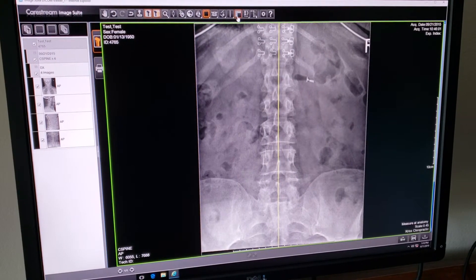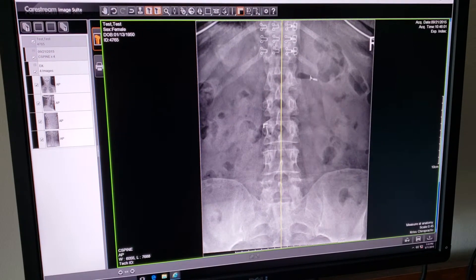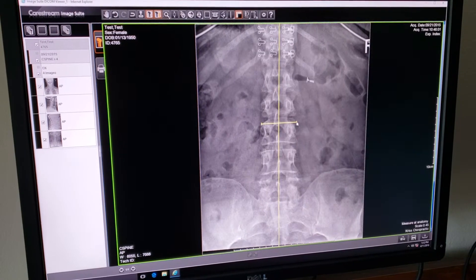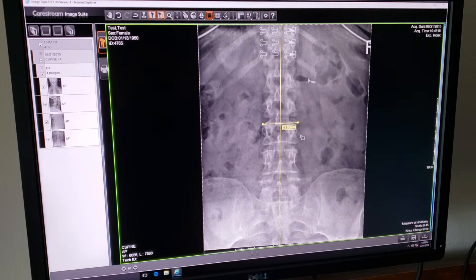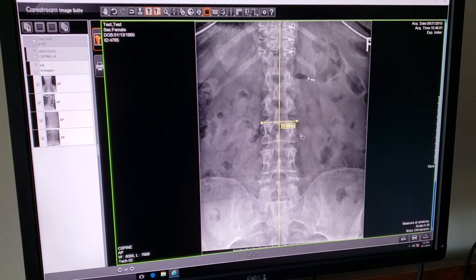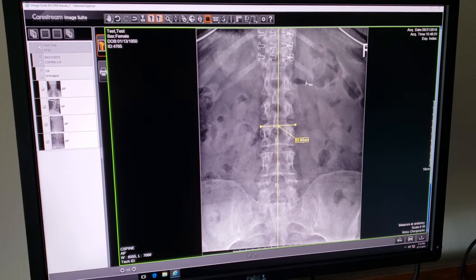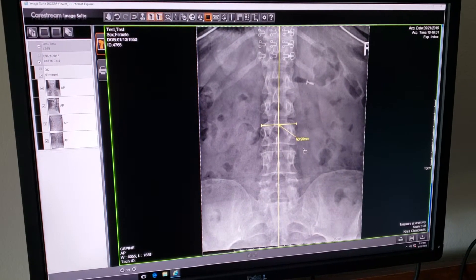The next tool is just a simple ruler. Left click and hold on your first point, drag it to your second point, let go, and click one more time — that will allow it to measure that distance. You can also move this measurement into an area where it's more visible. Click one more time and the tool will stop.